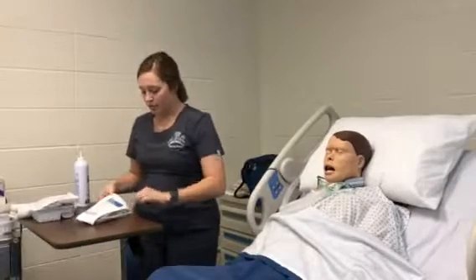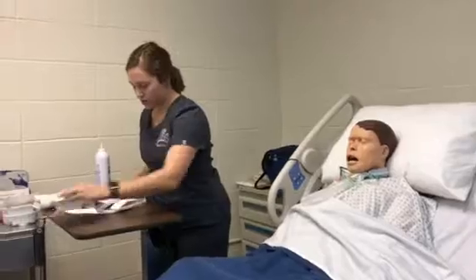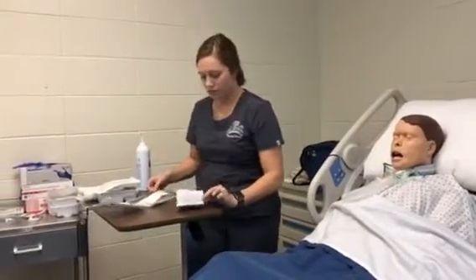I have my oxygen on him, as I said before, as high as it can go. Go ahead and open my sterile kit away from me. Get my sterile gloves out.